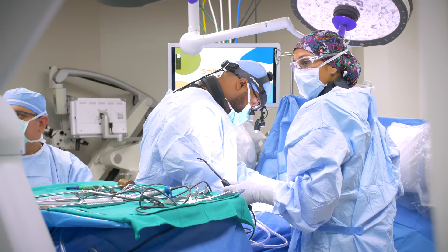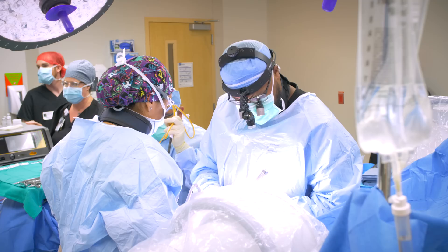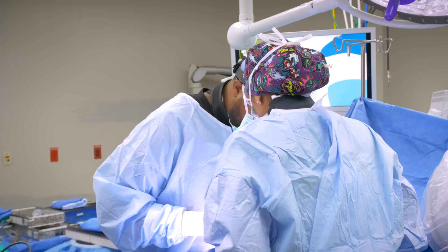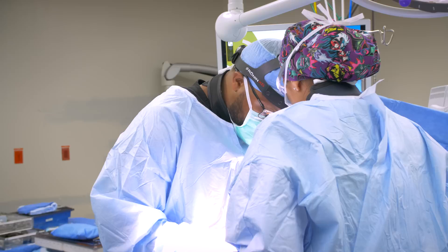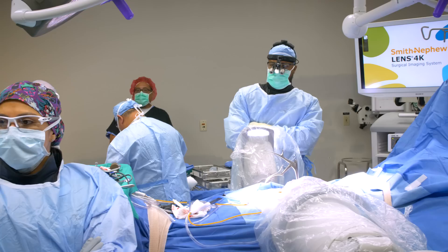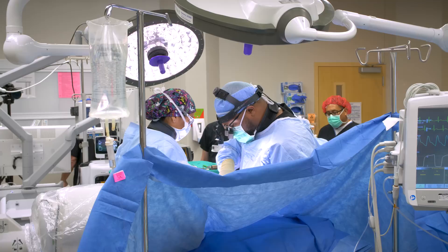That's the incision there. Right now we're dissecting down, trying to get to the part of the spine where we can see the bony architecture — pulling the muscles off the back. I'm using a rongeur here, which is used to grab objects — in this case soft tissue. There's usually a lot of soft tissue and fat sitting over the bone that I have to remove so we can see what we're doing. I have a Kerrison rongeur under the lamina. We're just localizing our level, making sure we're at the right level — there are so many different levels in the spine. We're going to take one more x-ray to confirm.